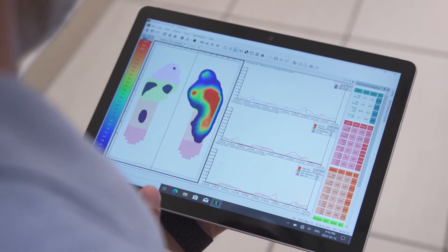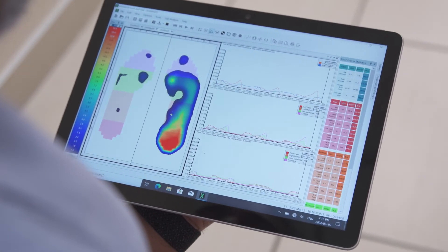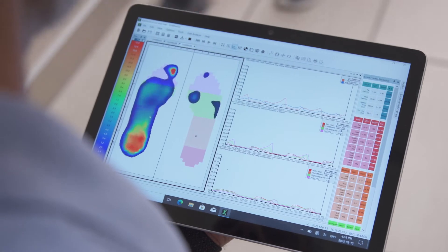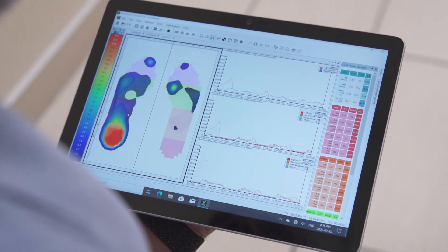The easy-to-use software visualizes load distribution and peak pressure, allowing you to analyze loading over time to understand where and how weight bearing travels through the foot.